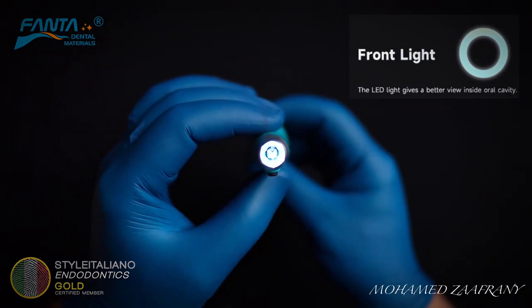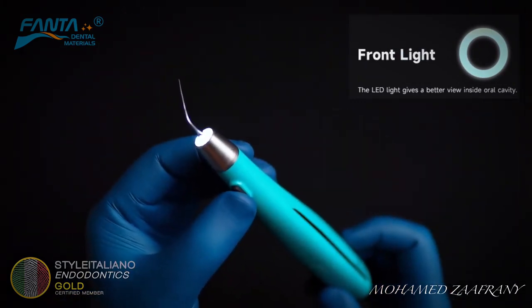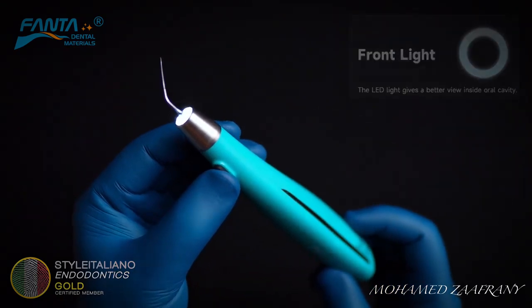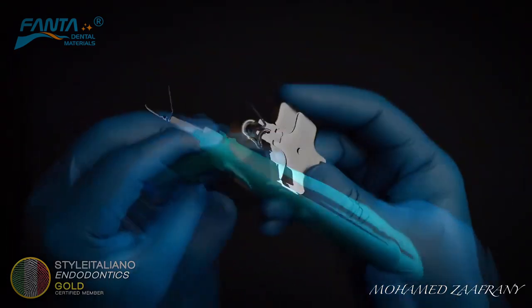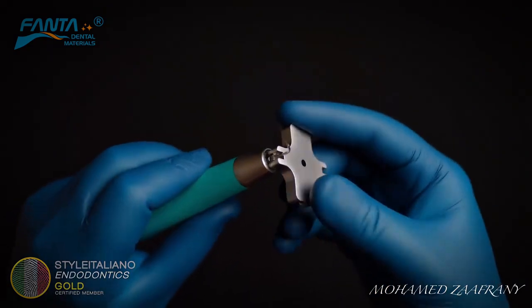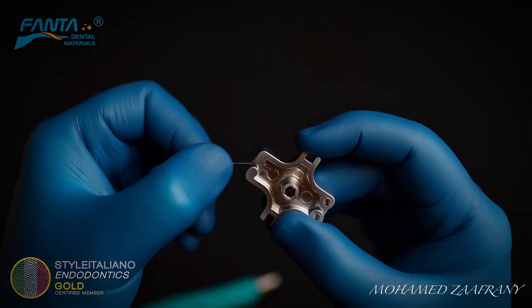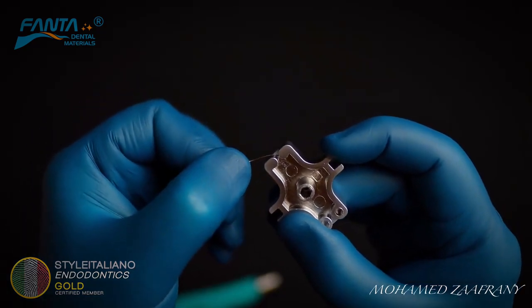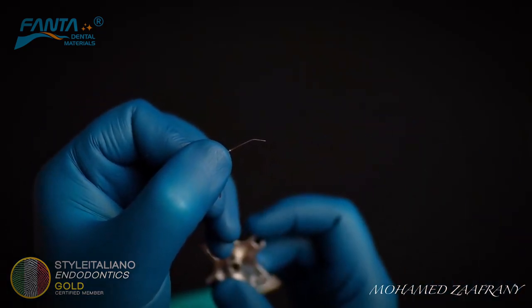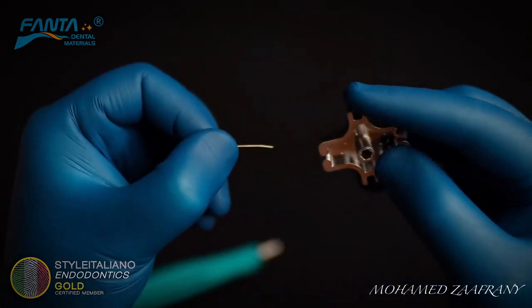It has a front light to help in illuminating the working field, especially if you are not using a microscope or loupes. You can use the key to remove the ultrasonic tip if needed, and also to resecure it.